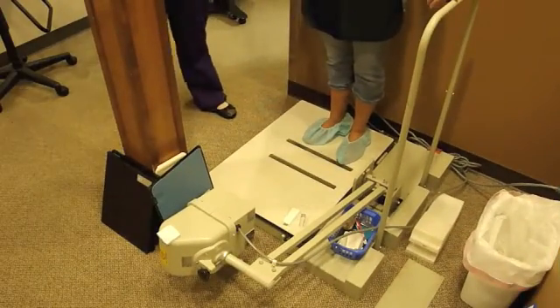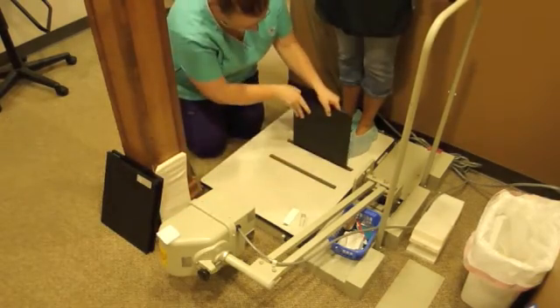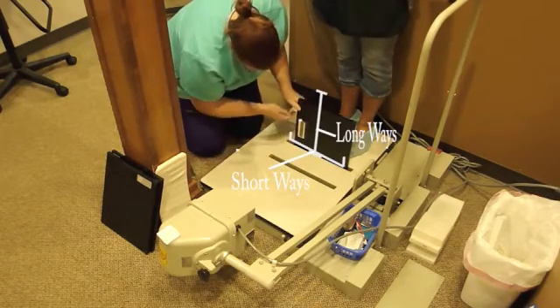To prepare the film and platform for taking an ankle view, you will need to make sure you place the cassette in the farthest slot back, but this time, instead of long ways, you will place it so that the long side is pointed up. You will not need to have a cassette holder.